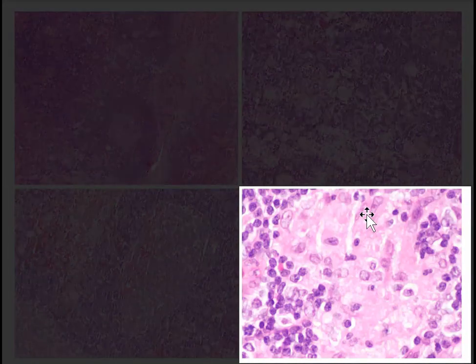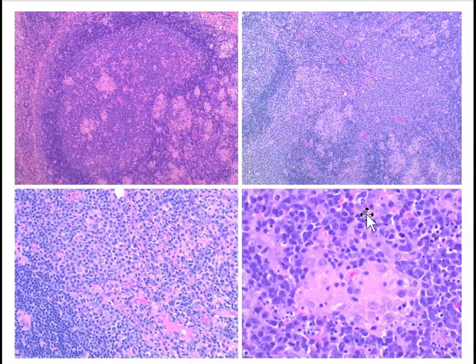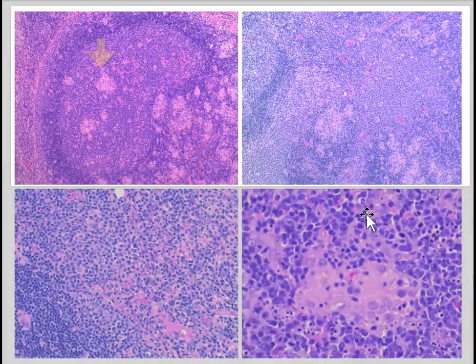Here is a high magnification view of the granuloma. Here we see monocytoid hyperplasia featuring sheets of monocytoid B cells with round and condensed chromatin, as well as ample clear cytoplasm separating the nuclei from adjacent cells. In this example, we see reactive follicular hyperplasia showing a hyperplastic germinal center and numerous granulomas both in the interfollicular region but also infiltrating the germinal center.